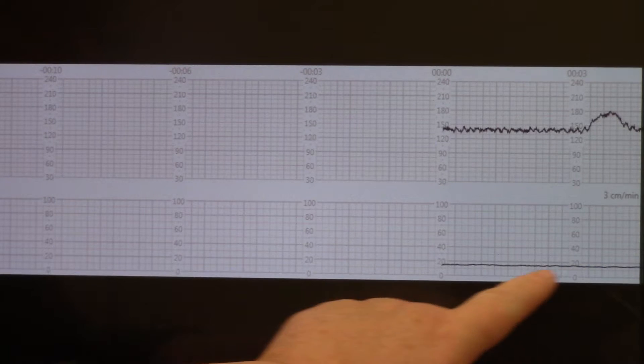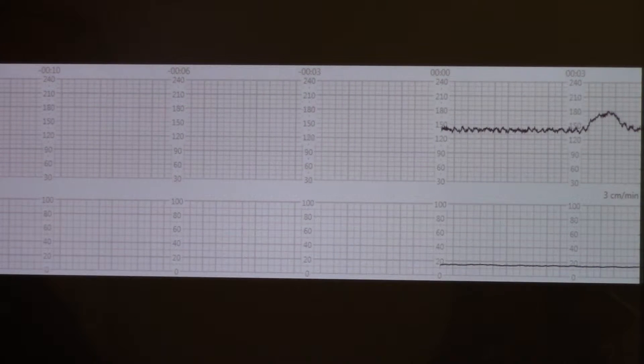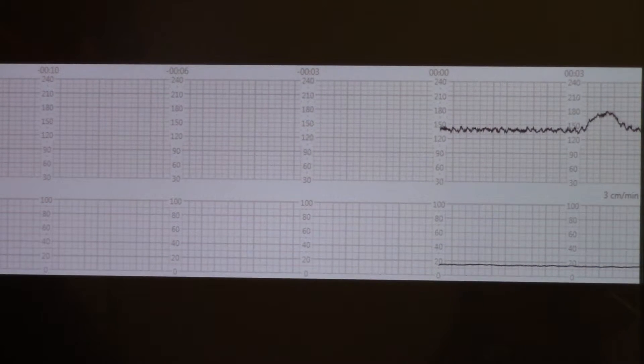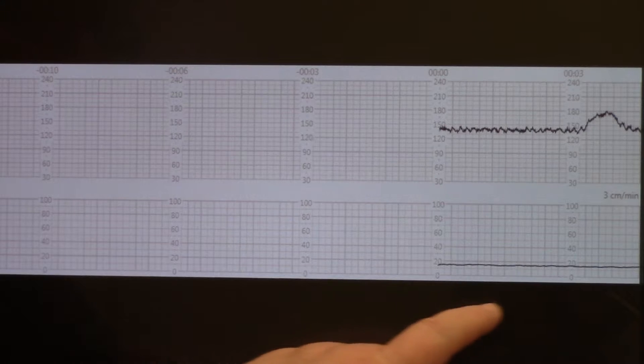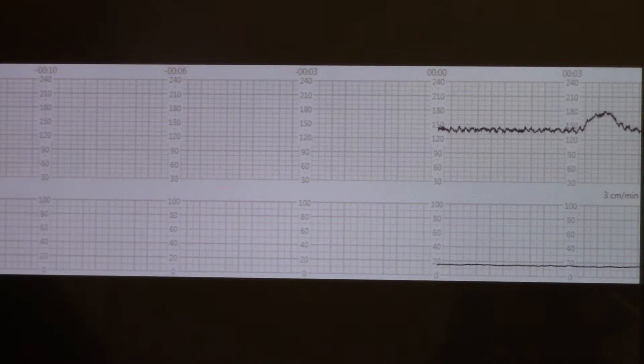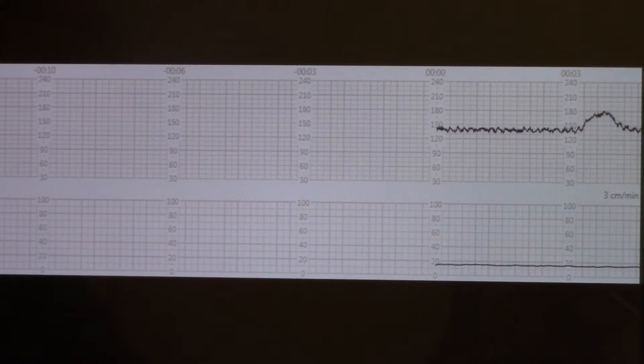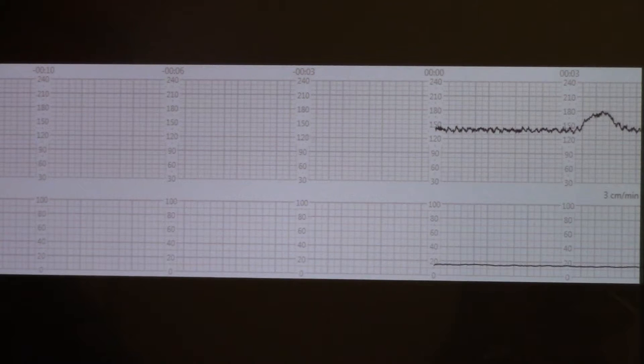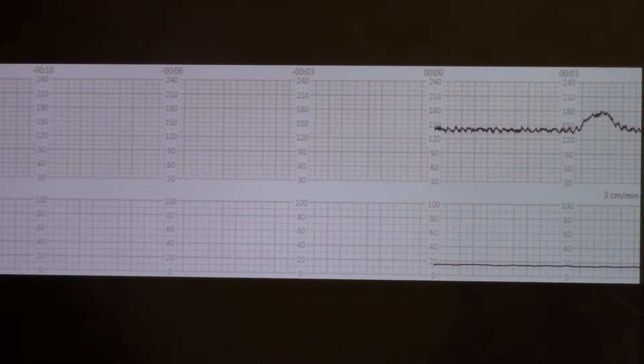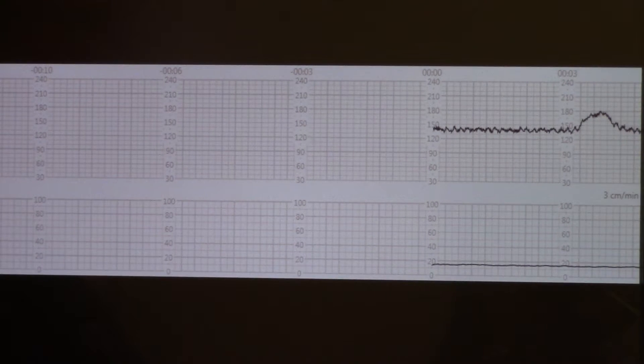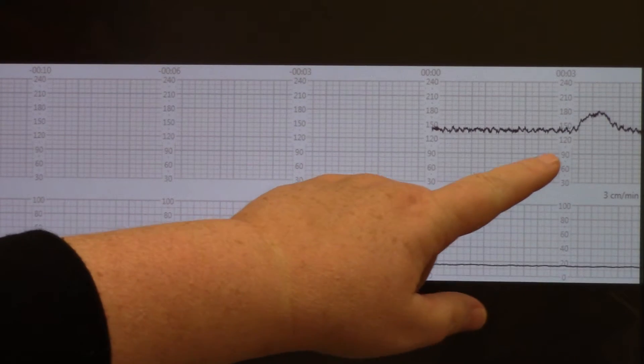You can see there's no contractions down here, so this would be called a non-stress test because there are no contractions on the monitor. We've already got one of our accelerations that we need. We needed the acceleration to go up by 15 beats, last for 15 seconds. Ours definitely did that.